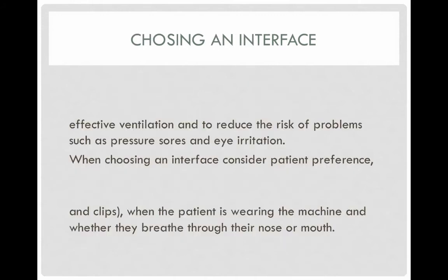The biggest thing that we worry about is, first off, that we have some amount of seal. Not that it's a perfect seal, they're going to leak some, but we need to be able to have a seal without creating pressure sores or air blowing into the patient's eyes. So this is a bit of an art. The two key factors are we need a good enough seal that there's not a huge leak, but we don't want these masks strapped on the patient so tightly that they develop pressure sores or just hate the device in and of itself, because the interface is what bothers people a lot.